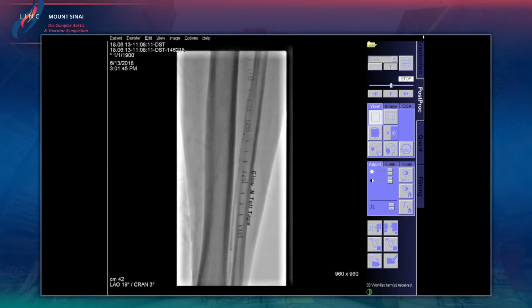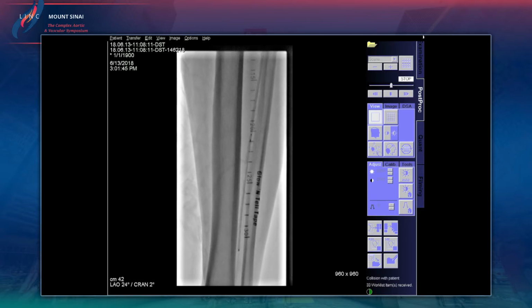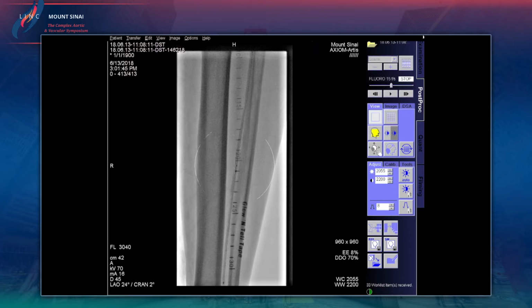I'm sorry, so a little bit of pressure. And what is this, a 3.0, 3.5, 220? So this is exactly that, Miguel, and it's funny because I know there have been a lot of opinions on tapering balloons. Some of us don't believe in tapering for these vessels. It makes sense to have a tapering balloon in this situation. But, you know, it is what it is. We have a 3.0, 2.5, 210 tapered balloon. I think, Brian, you don't believe in this tapering stuff, right? Yeah, I think vessels change at bifurcations and across the ankle. I tend to use straight balloons.